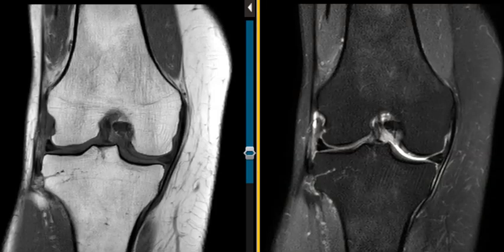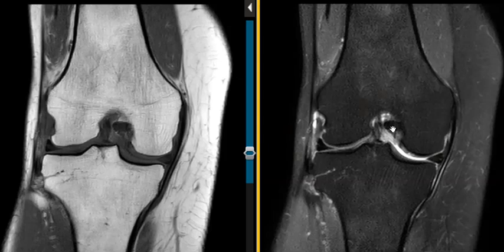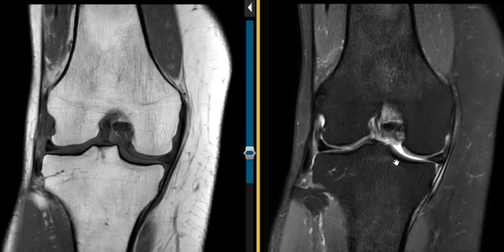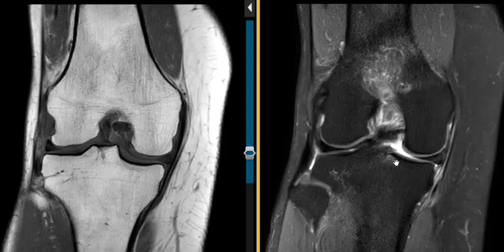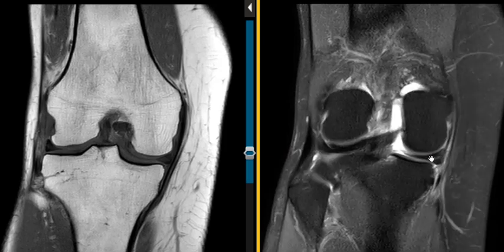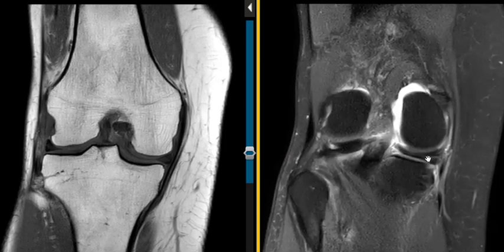Hello, this is Dr. Gay from First Lake MRI, and these are two patients I read back-to-back. The first one here is 73 years old. It's a right knee MRI. She had knee pain, and she has a tear of the medial meniscus. This is a common place to have a tear, right in the back where the meniscus attaches to the bone. This little bright spot here is fluid going into a tear.